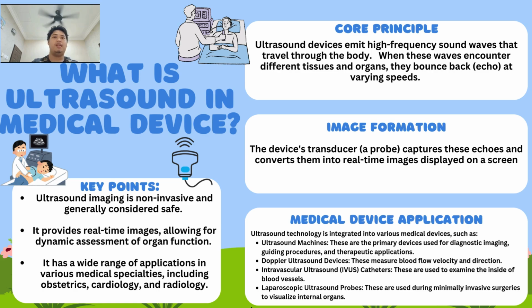For image formation, the device's transducer probe captures these echoes and converts them into a real-time image displayed on the screen. For medical device applications, ultrasound technology is integrated into various medical devices such as ultrasound machines, Doppler ultrasound devices, intravascular ultrasound catheters, and laparoscopic ultrasound devices. There are many applications of ultrasound in medical devices.